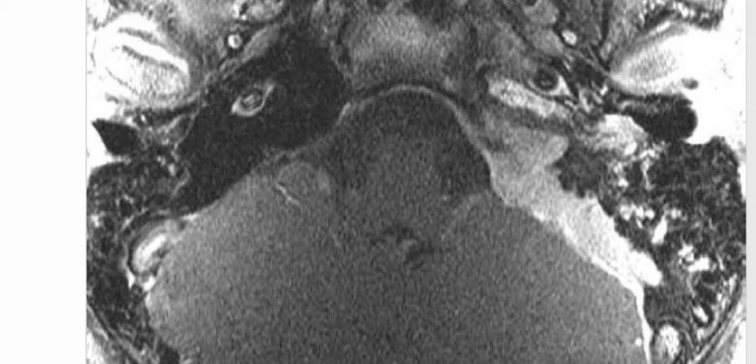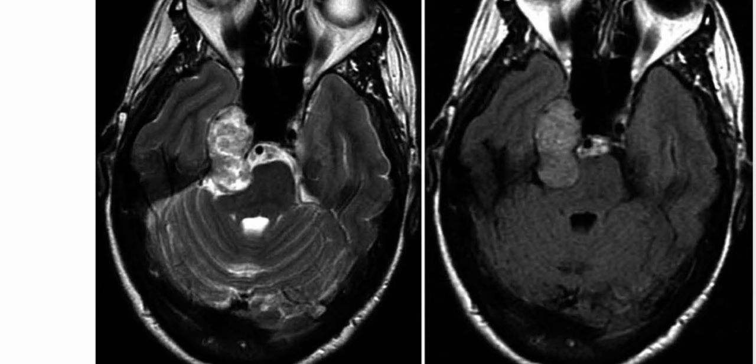Extramedullary hematopoiesis and Rosai-Dorfman disease, which is a non-Langerhans cell histiocytosis, most commonly occurring in children and young adults, can also involve the dura. This is a diagnosed case of plaque-like meningioma in a patient with NF2.